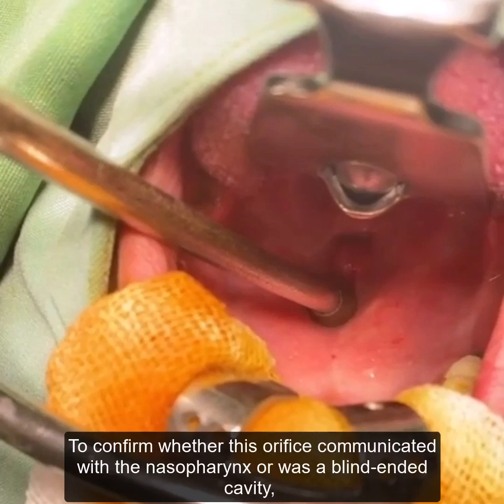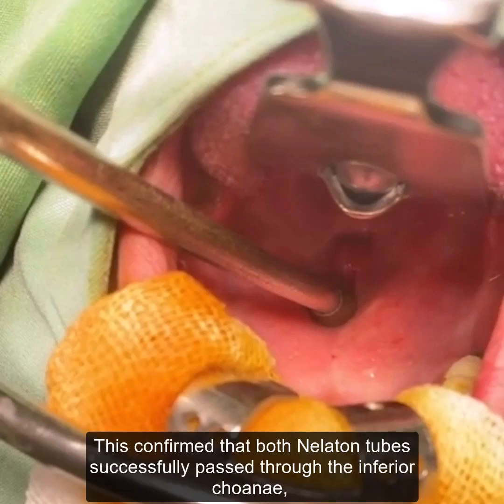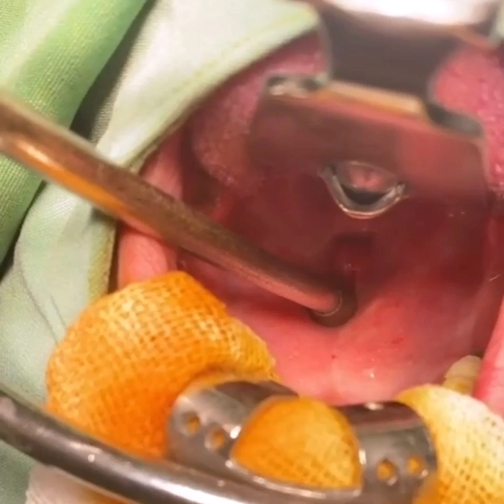uvula. To confirm whether this orifice communicated with the nasopharynx or was a blind-ended cavity, a black Nelaton tube was used, guided by nasoendoscopy through each nostril. This confirmed that both Nelaton tubes successfully passed through the inferior choana, emerging at the posterior orifice of the uvula.